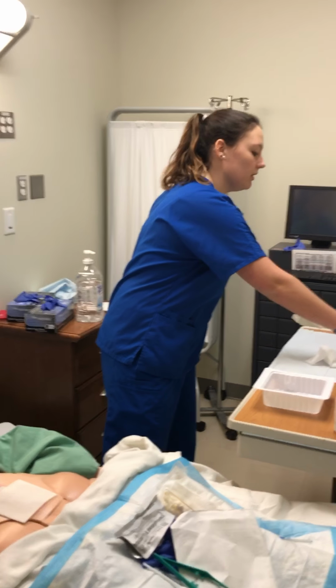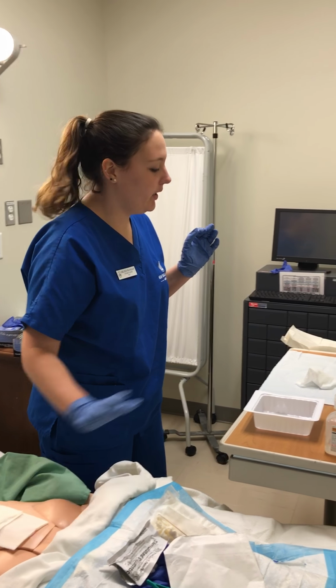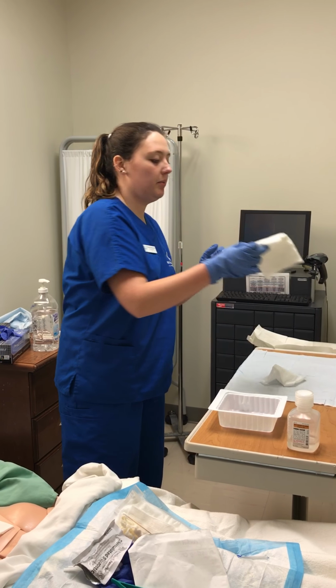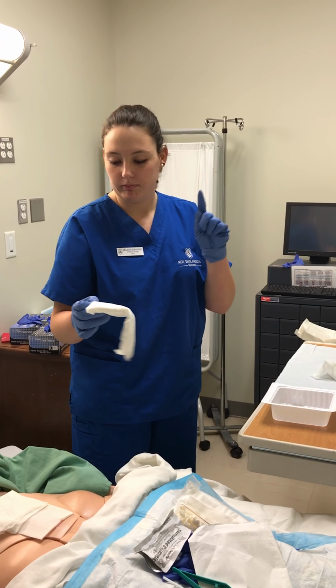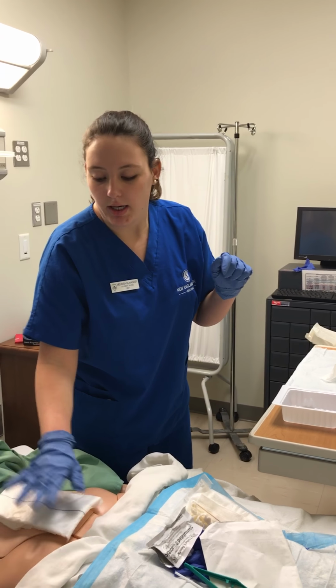two 4x4s on top. Yeah, that's not, I can't reverse it. Okay, now on top of that, I'm going to put my ABD pad down. Careful not to use this hand. Very tempting at times. Okay.